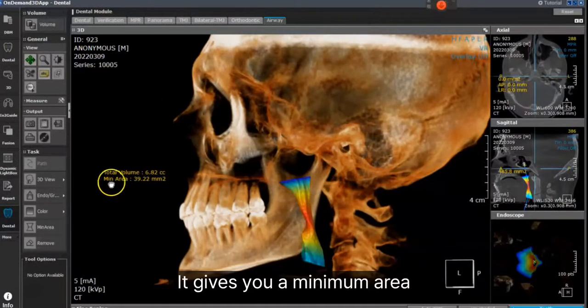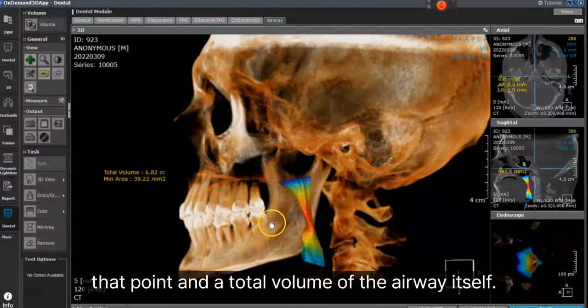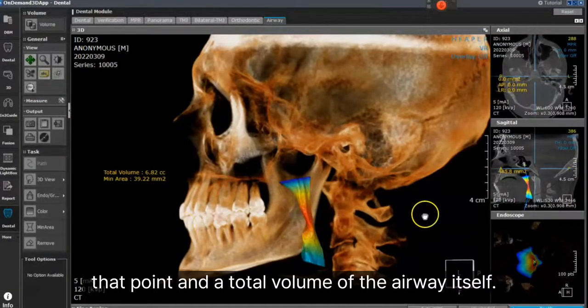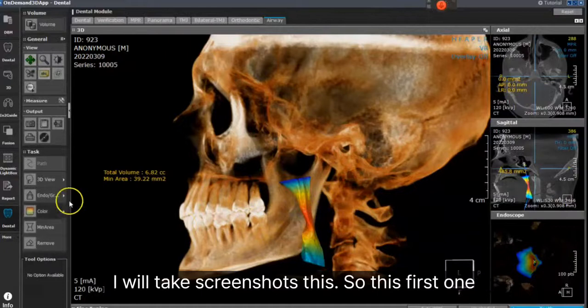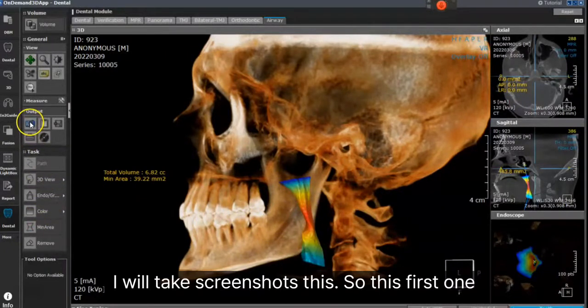It gives you a minimum area at that point and a total volume of the airway itself. I will take screenshots of this.